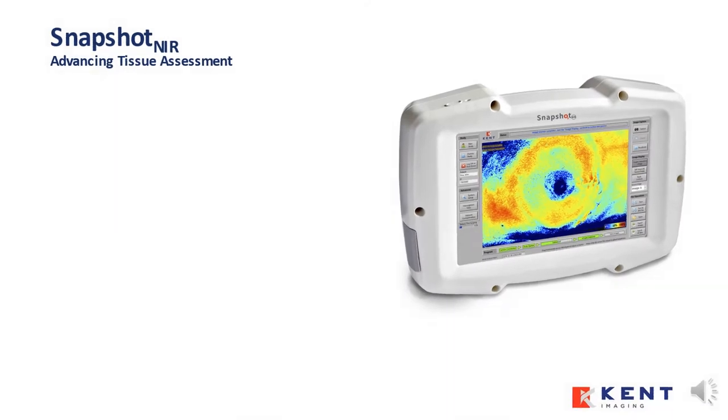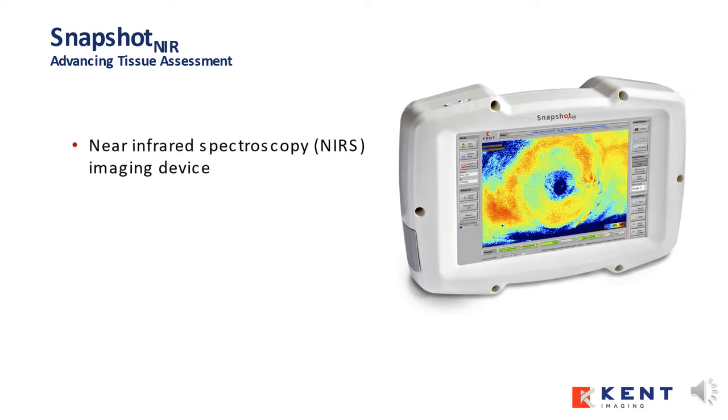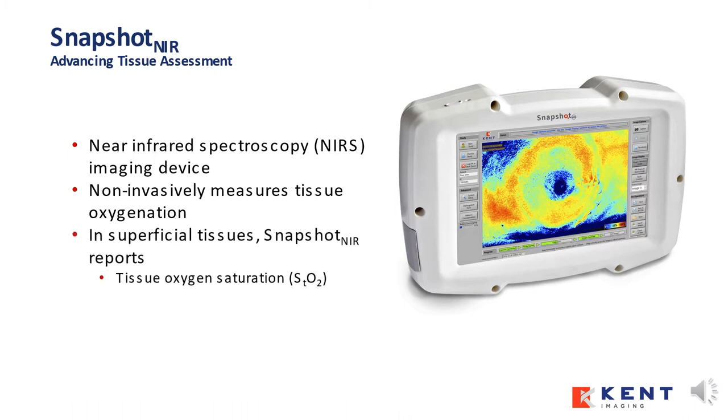Kent Imaging is advancing tissue assessment with SnapshotNIR, a near-infrared spectroscopy imaging device that non-invasively measures tissue oxygenation. SnapshotNIR reports an approximate value of oxygen saturation, or StO2, as well as relative oxyhemoglobin and relative deoxyhemoglobin in superficial tissue.